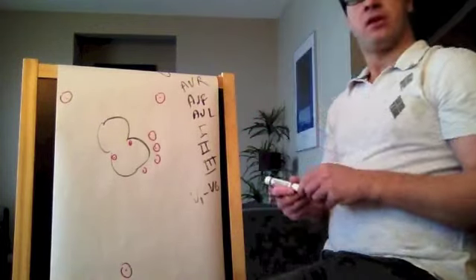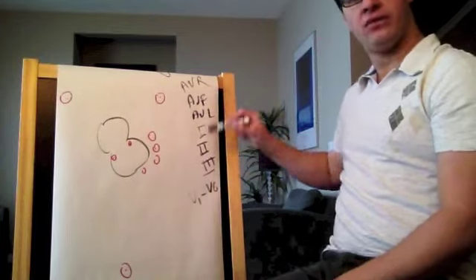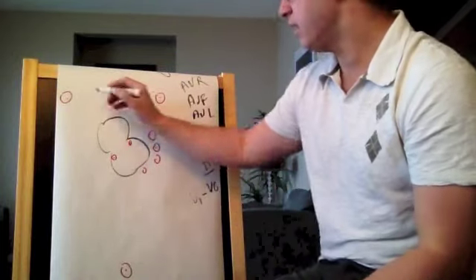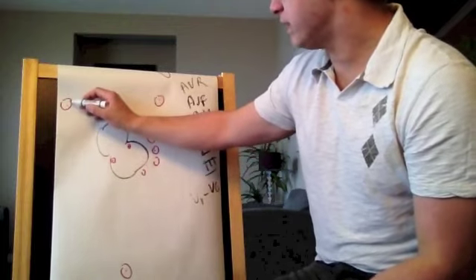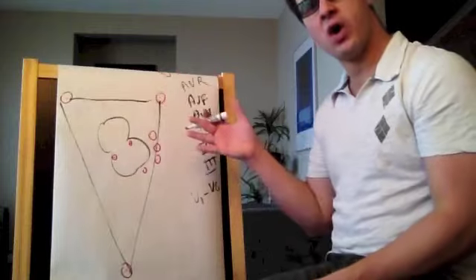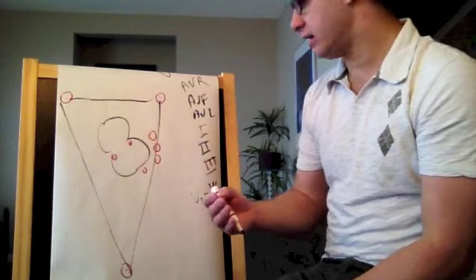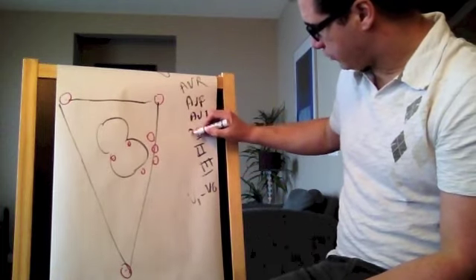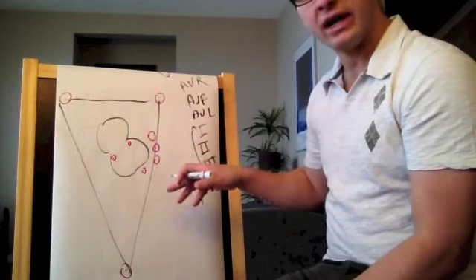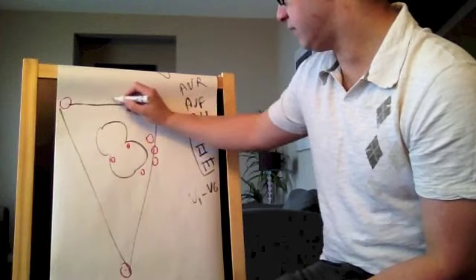Let's start with those 3 over here, and they're part of a triangle. I forgot the name, I think it's a Russian name. But anyway, it's the basis of this, and it reads the triangle that way. We're talking about those three right now, leads 1, 2, and 3. So lead 1 will read the electricity going from this one to this one.